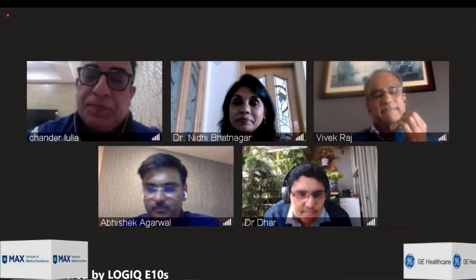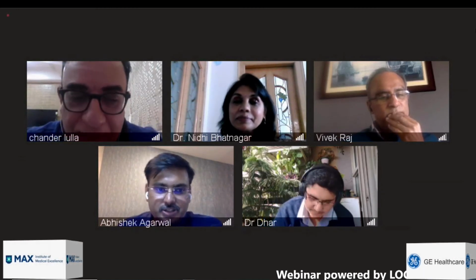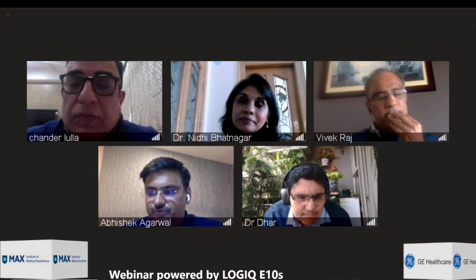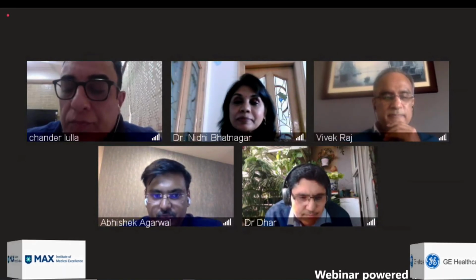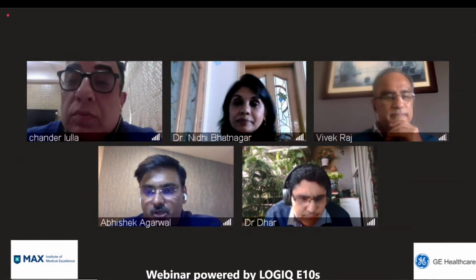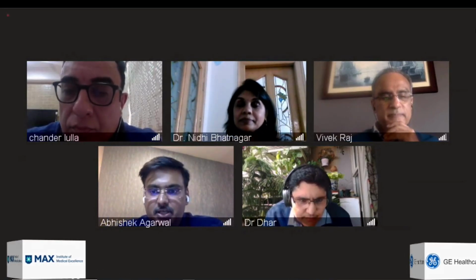Dr. Lulla, for want of time, I will come back to basics, Dr. Dhar, if it's okay with you. I just want to cover some basics of elastography for the sake of the audience. First, Dr. Dhar and Dr. Vivek, you must have seen a lot of discussion about these IQR/M values while we do an elastogram, to keep them less than 30% for the sake of accuracy. And that is something you should always see in any elastography report from any radiologist, how good these IQR/M values are.